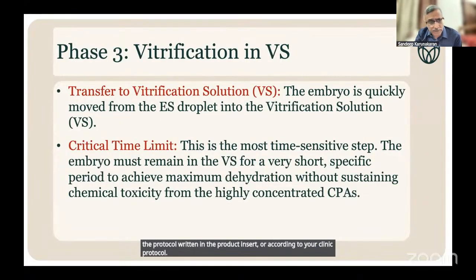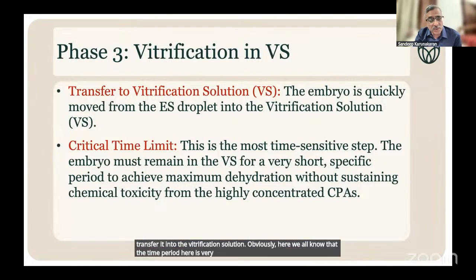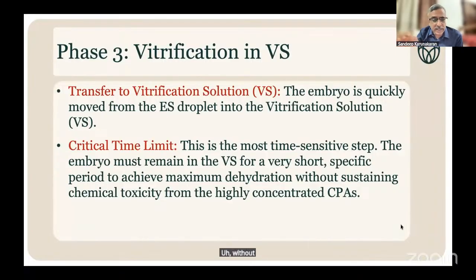Transfer it into the vitrification solution. Obviously, here we all know that the time period is very, very critical. It has to be very short and specific, to achieve maximum dehydration, but without sustaining chemical toxicity because of the high CPAs which are concentrated within the cell.